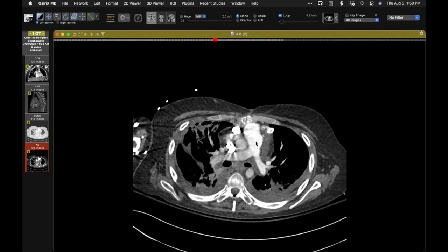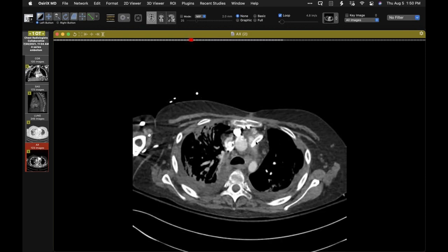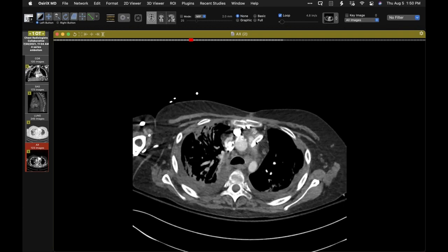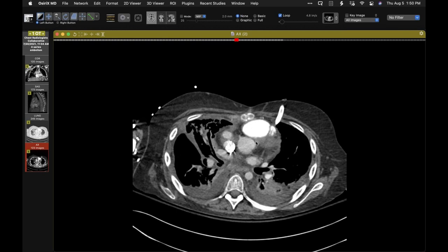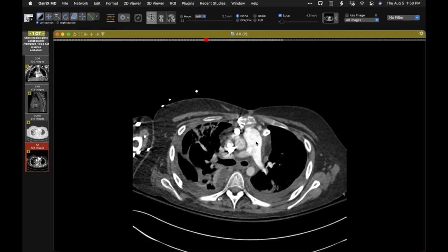I've not encountered this before, but I was thinking if this was intended to be a CTPA and you knew the anatomy and you knew the presence of the cannula there, would you just do it in the usual fashion? Or perhaps would you ask the surgeon to clamp off this cannula just for a few seconds while you inject contrast medium in the usual way? I've not encountered that before. I know I've modified the technique in patients on a central AV ECMO, but this is a little bit different from that, a different situation. Any thoughts?